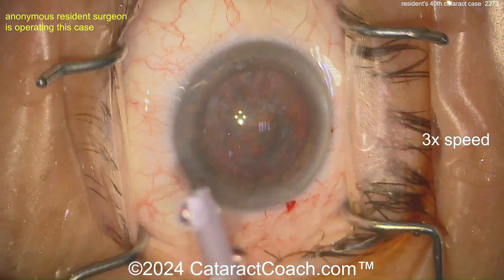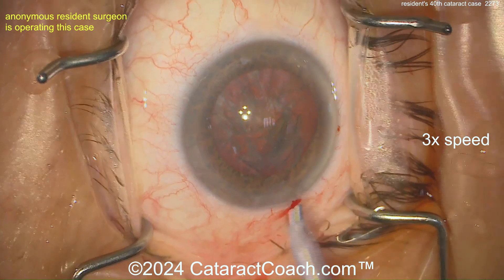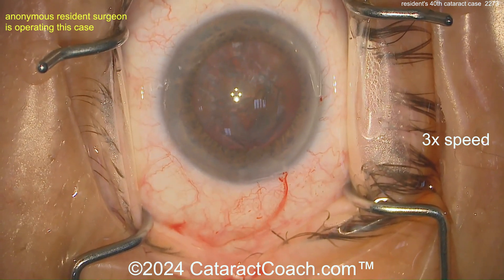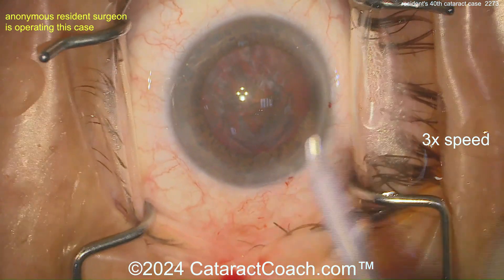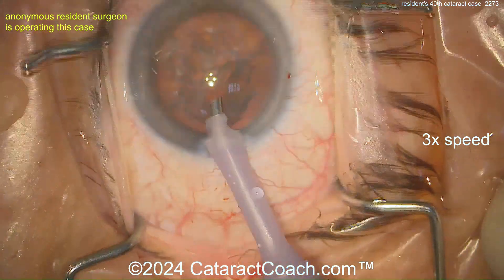Now let's see the technique. Phaco probe going in — looks like a 275 purple sleeve, a 2.75 to 2.8 incision. I like the little bit of bleeding from the limbal incisions. These corneal incisions are nicking those limbal vessels, which I think is a good thing — it helps them seal up with time. Okay, getting that probe in the eye — let's do it, there we go.